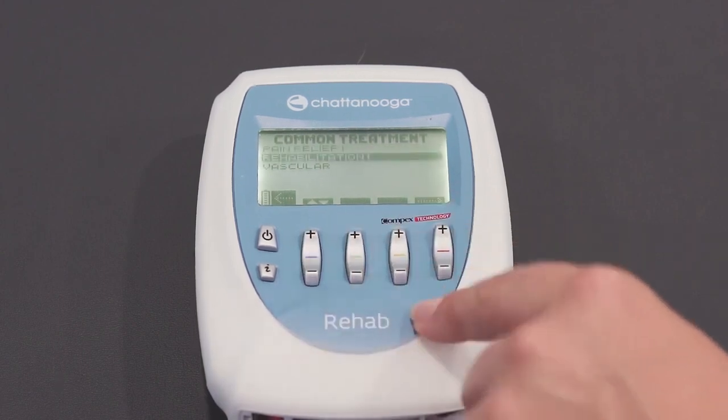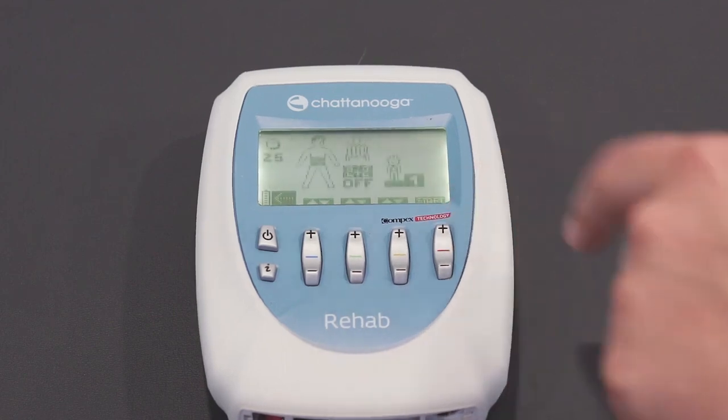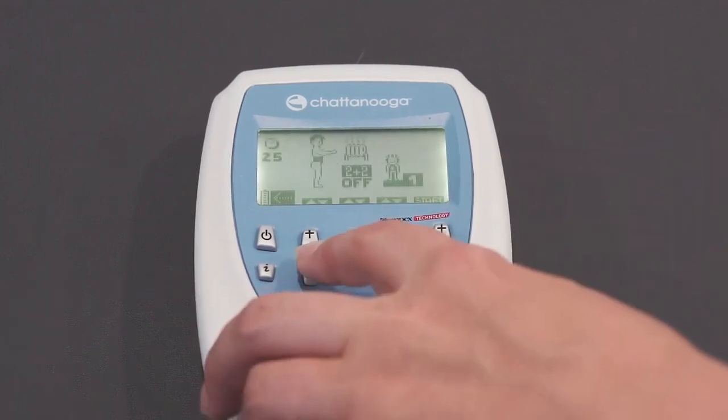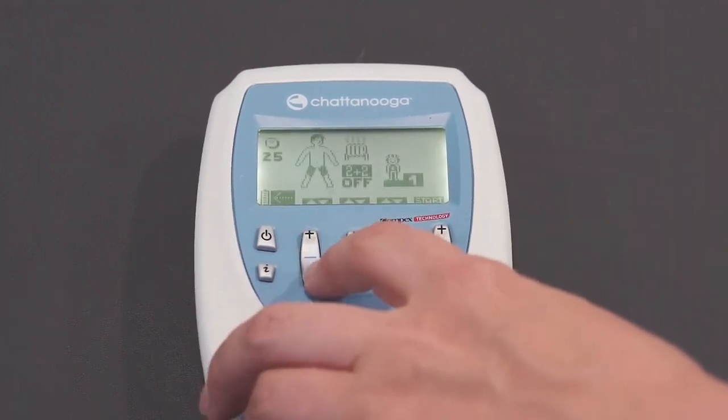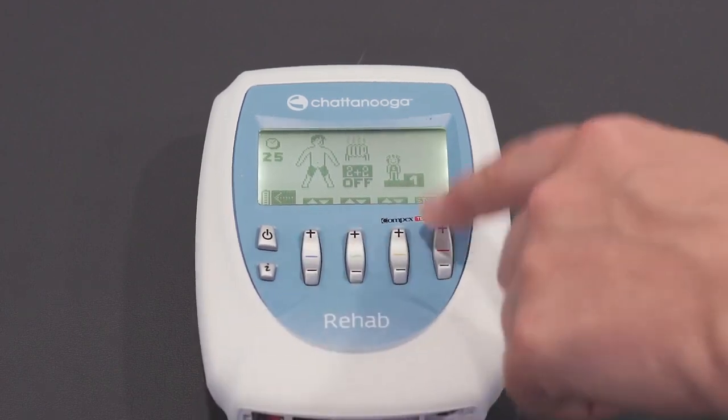To start with, press enter on common treatments. Scroll down to rehabilitation 1 and enter on disuse atrophy. You need to let the machine know which part of the body you are targeting. Scroll down until the quadriceps area is blacked out and then press start.